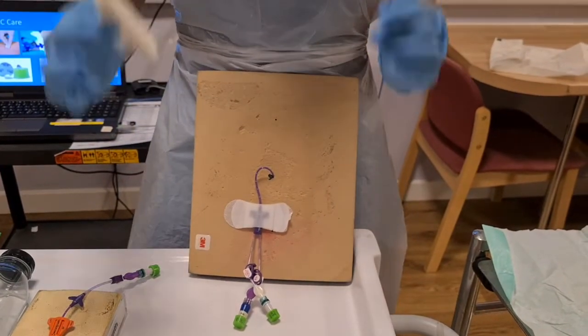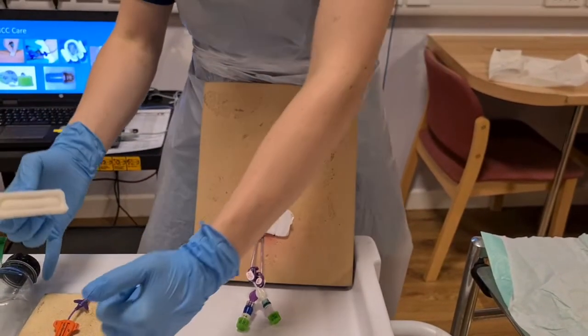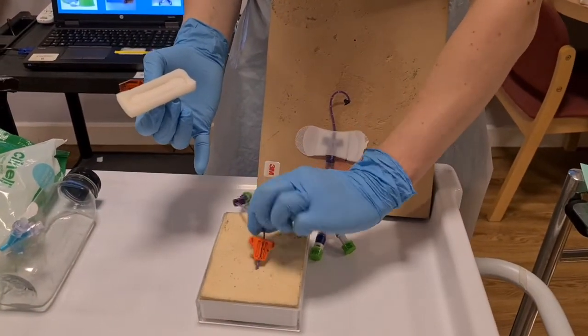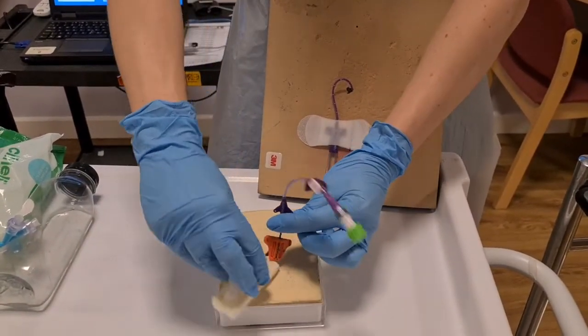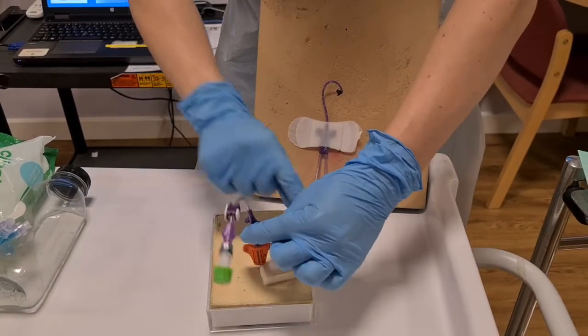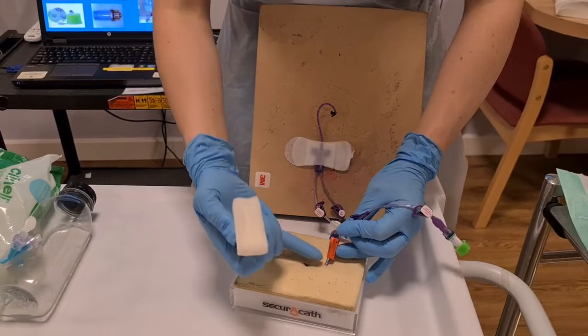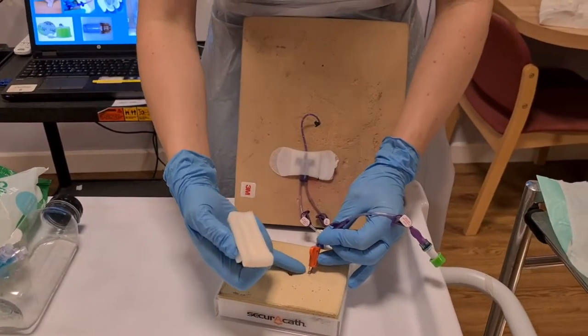There we go. If I was cleaning a Securicath, what I would do is pick the line up and do 360 degrees all the way around the outside, making sure that I'm getting any bits that are in between the PICC line and the Securicath.